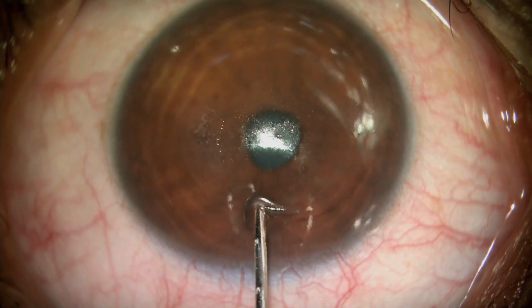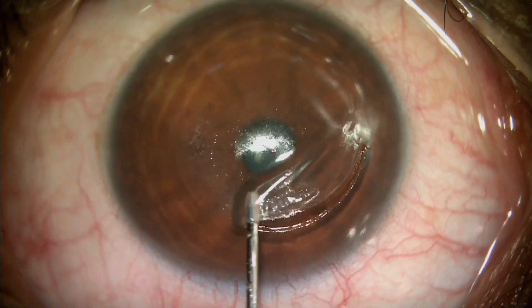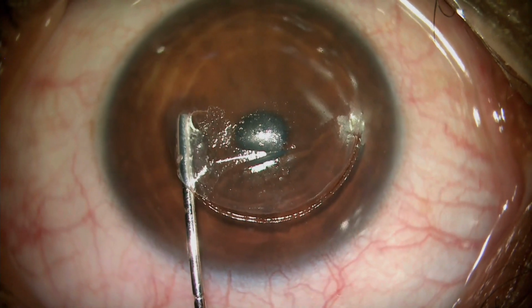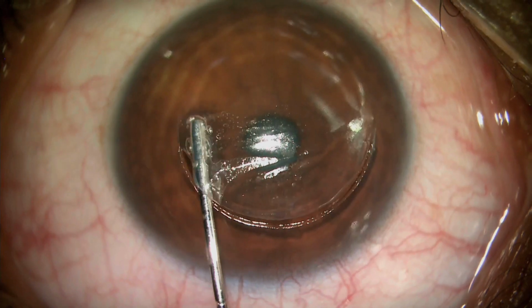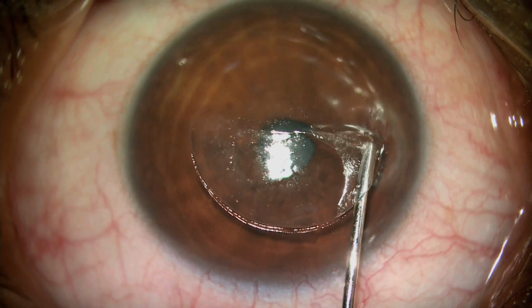I would like to show an interesting case when we first started doing SMILE surgery in our hospital, where we were asked to do a few cases of FLEX. This was a learning case for all of us. As compared to SMILE, FLEX requires a much bigger side cut, which probably exposed the patient to a high risk of complications. As the hinge was inferior, the lid movements played a role in such cases.